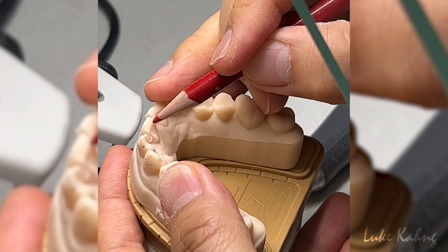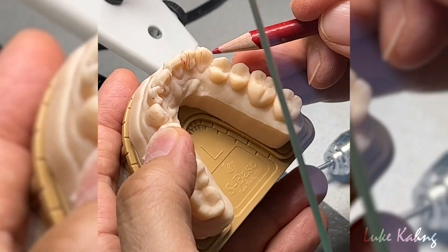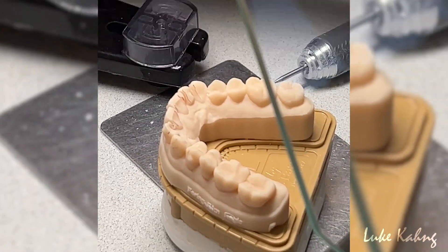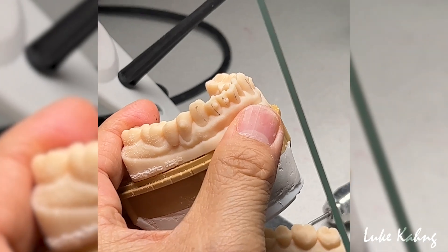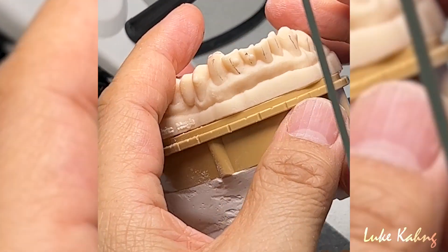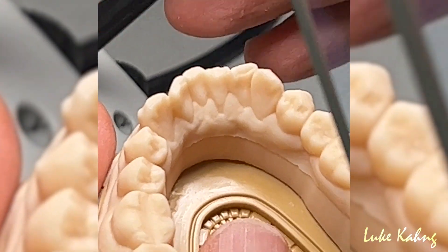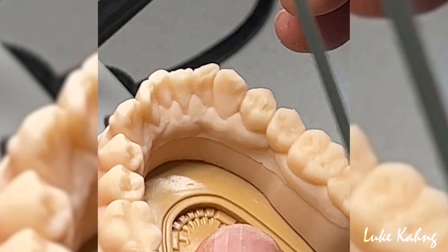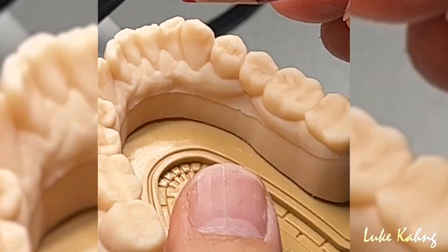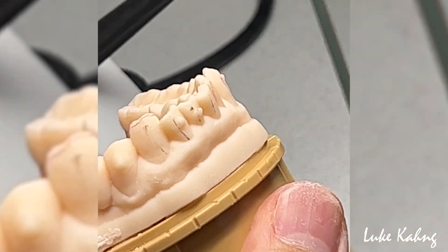It takes about more than 45 minutes. It's natural teeth. Now it's lower teeth compared to upper — it's too long. I'm going to cut it. It's all slanted, so making all crown is better. We're going to make a 6 unit bridge, all natural teeth. Then I can cut it in between the tools.